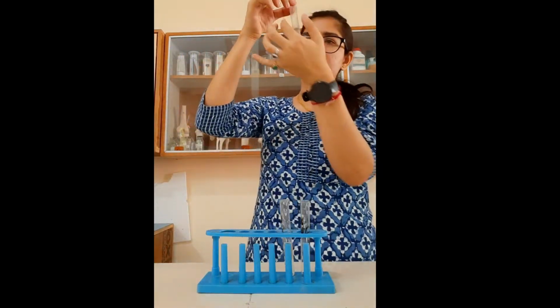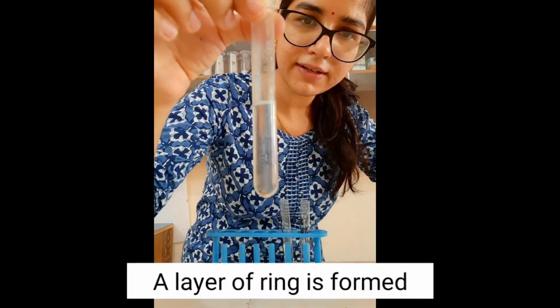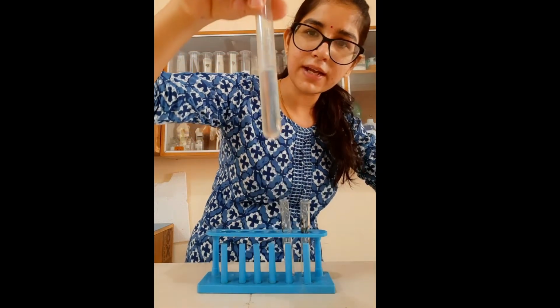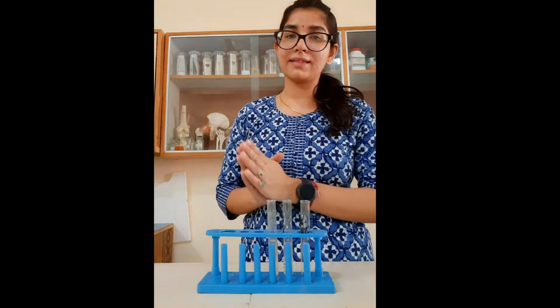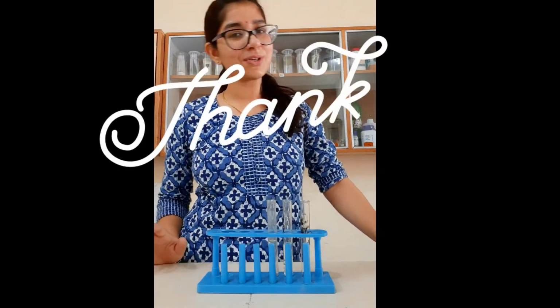And as you can see, there is a ring formed at the junction. At the top there is a ring, right? It confirms the presence of albumin in the urine. The test is known as Heller's test. It's a very easy test to confirm the presence of albumin in the urine.